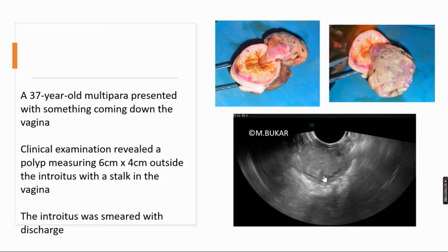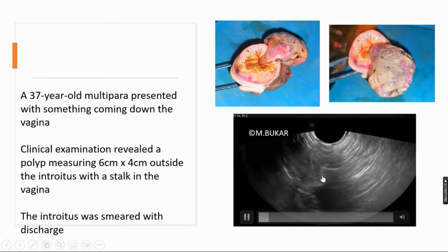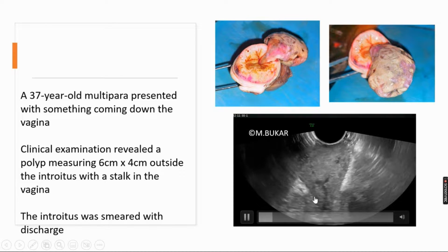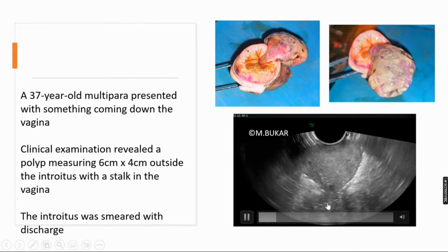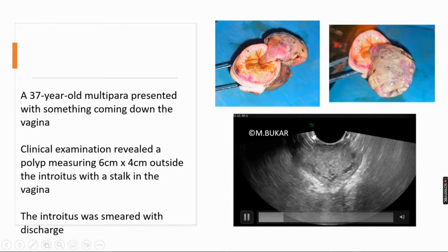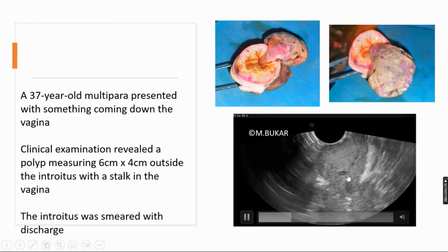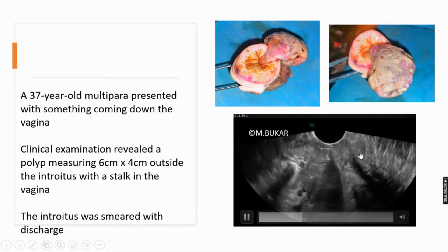This is the ultrasound image of the polyp. You can see the heterogeneous lesion here with the stalk going into the vagina and cervix as seen here. Note this vascular flow literally hugging the polyp.